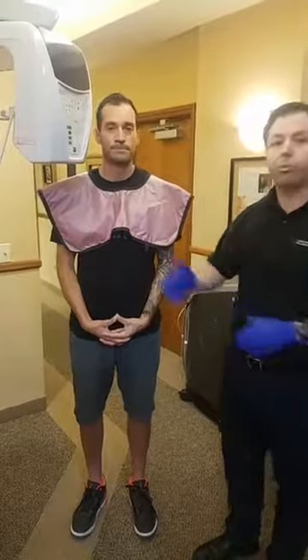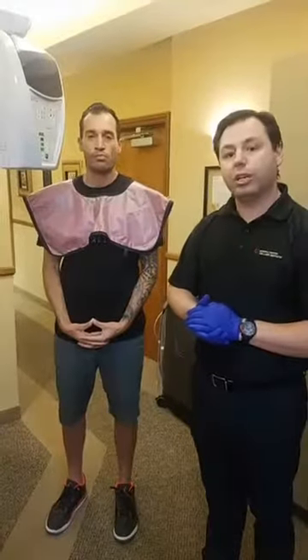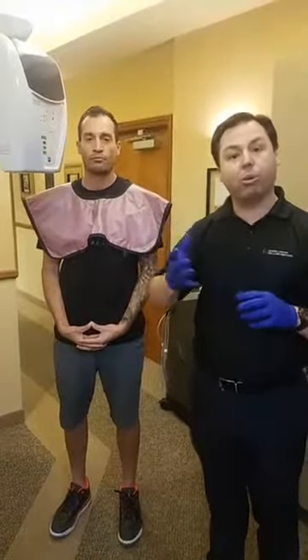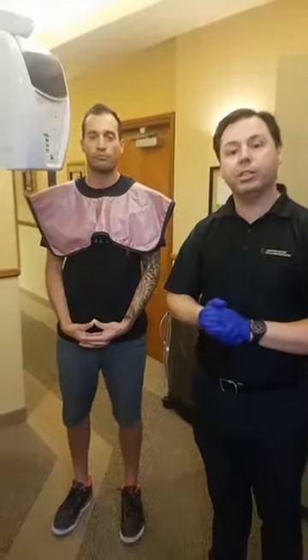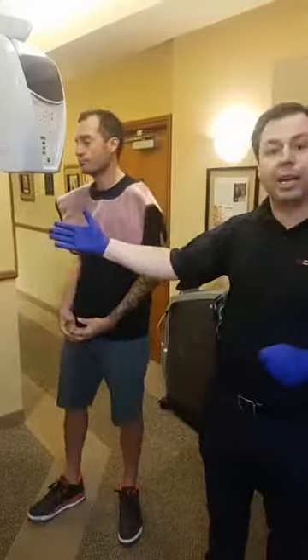Yes, sir. All right, what we're going to do is put David in our 3D machine, and we're going to use the technology that we have to three-dimensionally capture the area in his mouth, not the whole head, but the specific area in his mouth where we're going to place an implant today. And we'll do this in 9.4 seconds.